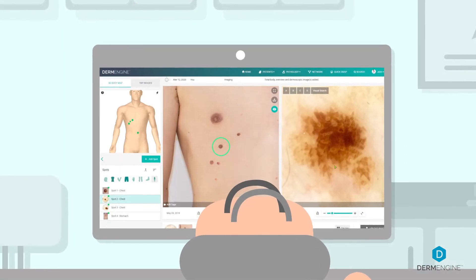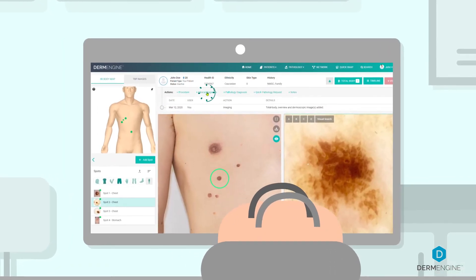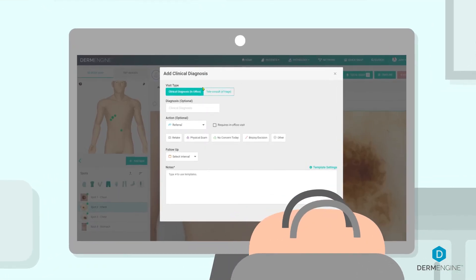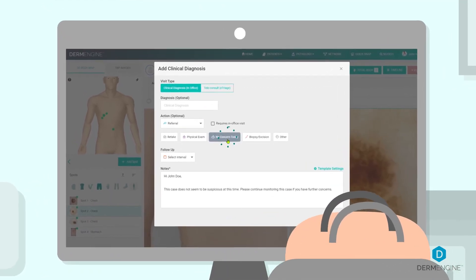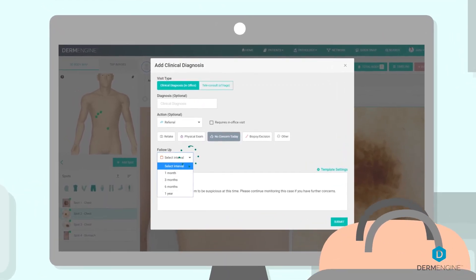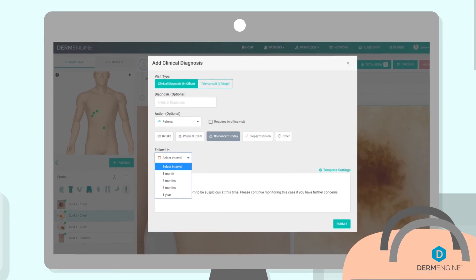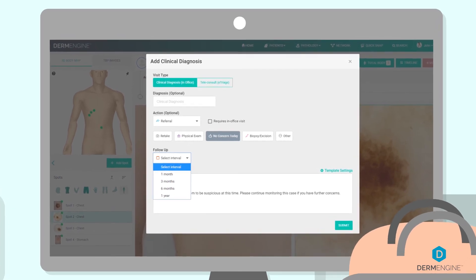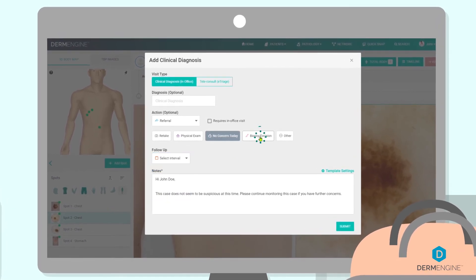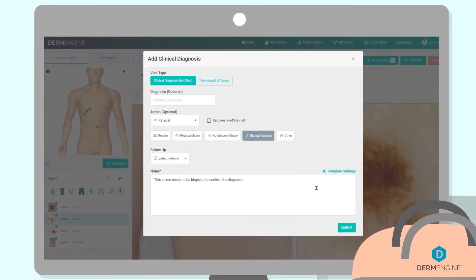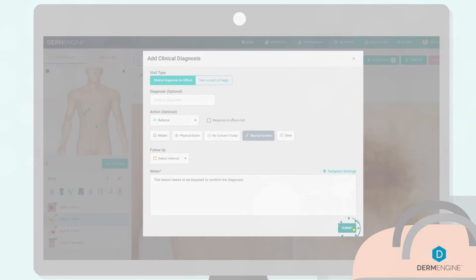From here, the specialist can review the images and mark them as no concern today, requires follow-up, or document the appropriate procedure, pathology request, or treatment notes when necessary.